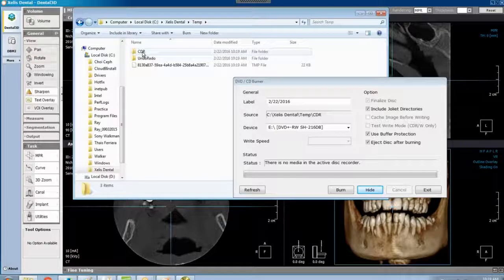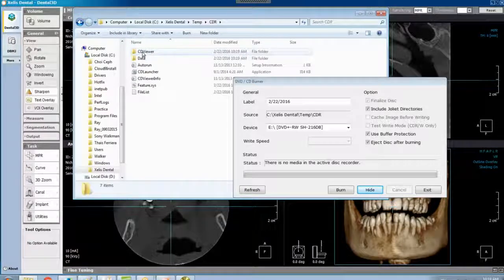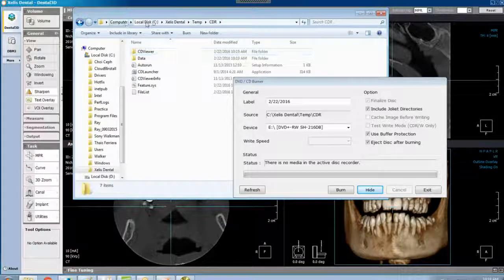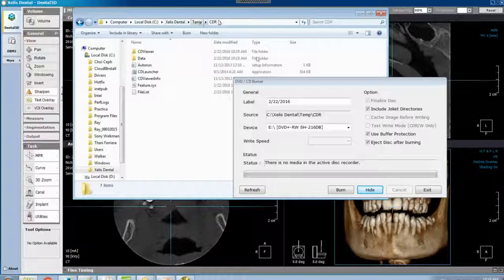Double clicking on CDR. You want to make sure that your header, C drive, Zealous Dental Temp CDR matches the source.